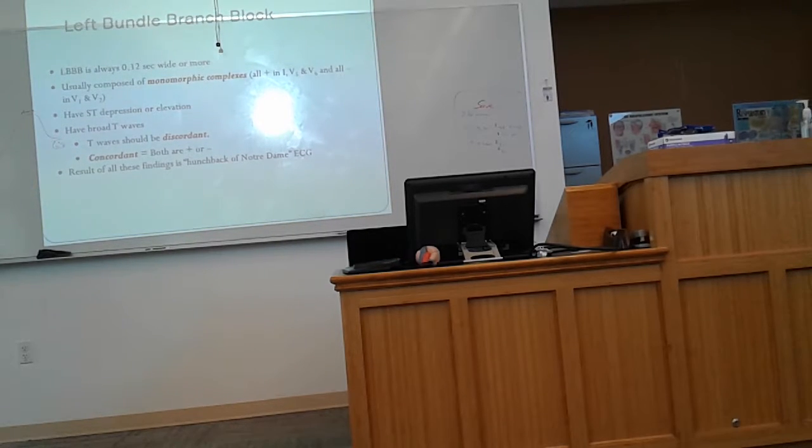I don't care what you remember, but some people like to put that. And we can't call that ST elevation. Even though the ST segment is up here, we can't call it ST elevation. In the context, we can call it ST elevation, but we can't make it mean what ST elevation normally means. It's not MI. So we would say it's a left bundle branch block with ST elevation? No, because in a left bundle branch block, ST elevation is normal.